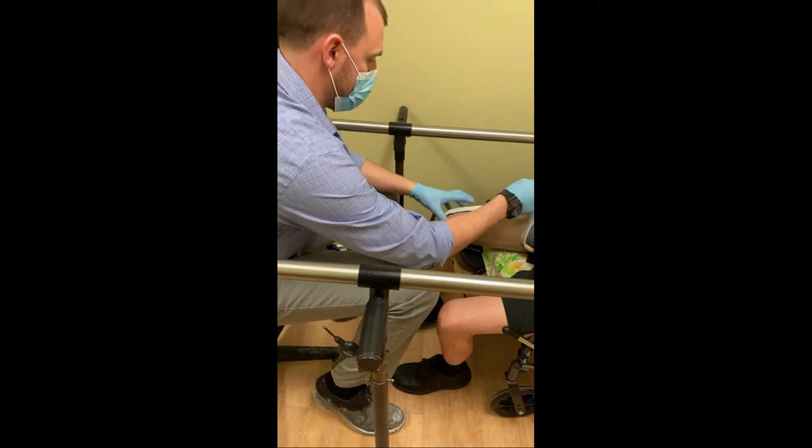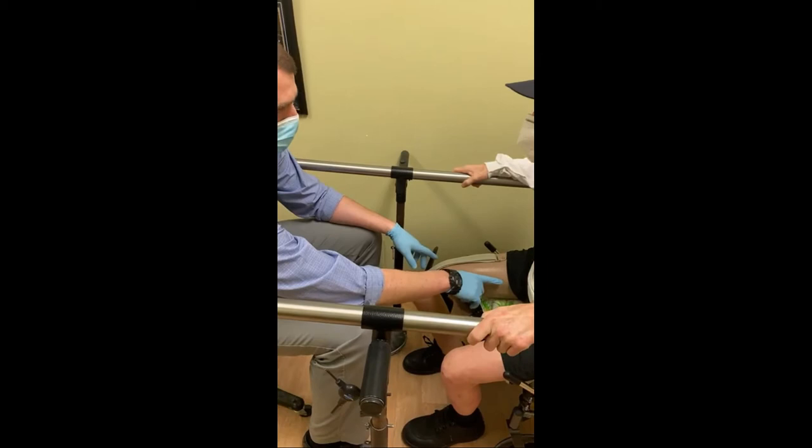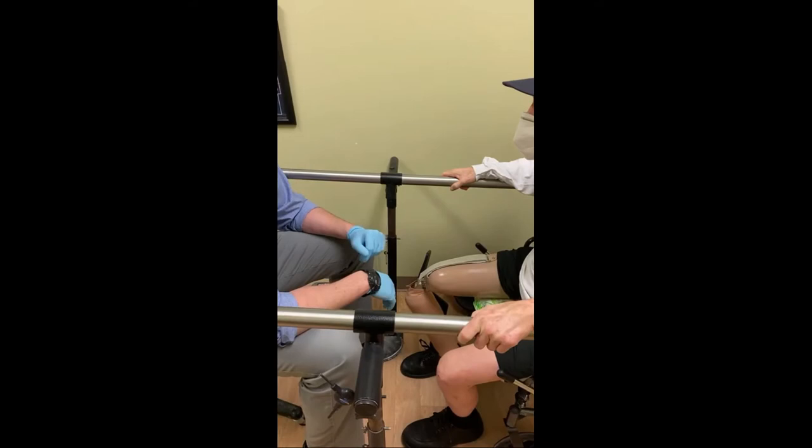So we put that as far as we can while you're sitting. We tack it down. Then we're going to have you stand up, and we'll work the shorts over the top edge of it. I blew out that medial trim line there — yes, in the groin — and I also put padding on that back seat. That's great.